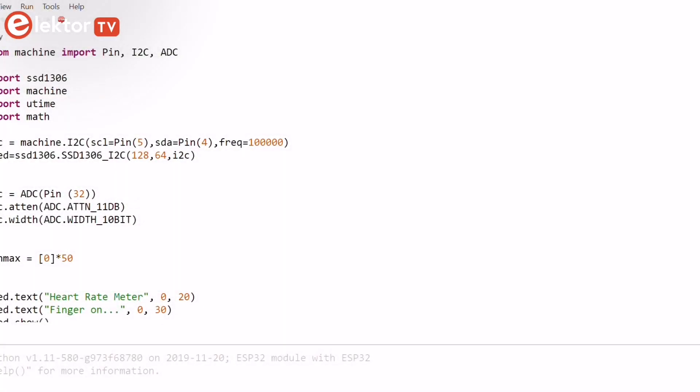Now let's take a look at the program. At the beginning of the project the OLED and the pulse sensor interfaces are defined. The ADC is set with an attenuation of 11 decibels so that the input voltage range is 0 to 3.6 volt. The ADC resolution is set to 10 bits.